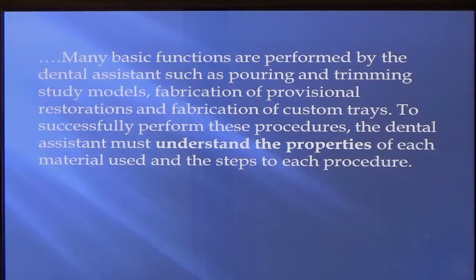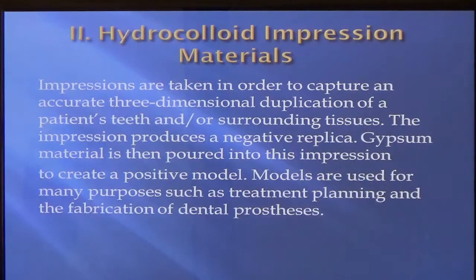And that's important because, again, if you add too much water, that material is going to do something. If you add too much powder, the material is going to do something else. Same thing when you're mixing the stone. If you add too much water, it's going to be too runny. If you add too much powder, it's going to be too dry, and they're not going to behave the same. If the water is too hot or the water is too cold, they're not going to behave the same. And some of the questions are on the test, and we'll cover those.